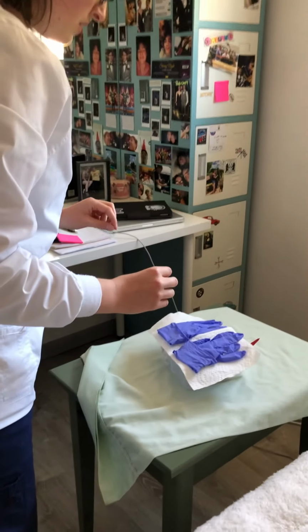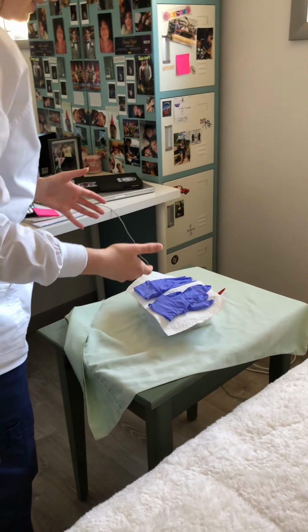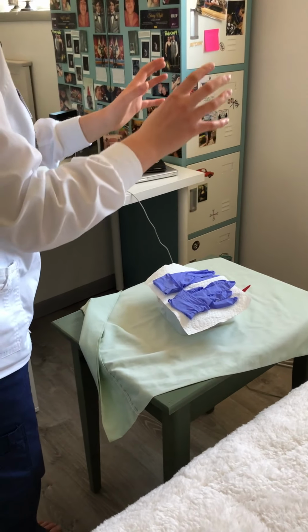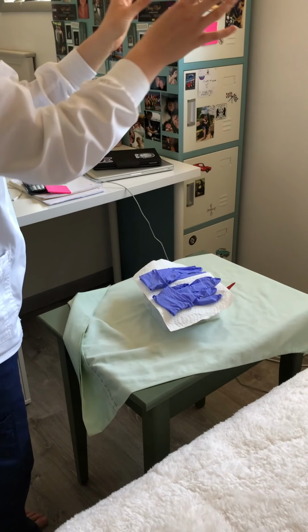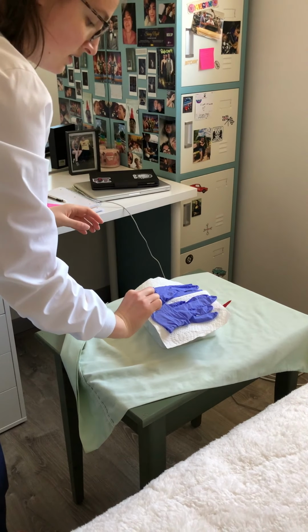Okay. And then we have the sterile gloves. So I would go ahead and don these sterile gloves, making sure to keep the gloves away from my hands so I don't contaminate, and then keep my thumbs forward, all right?